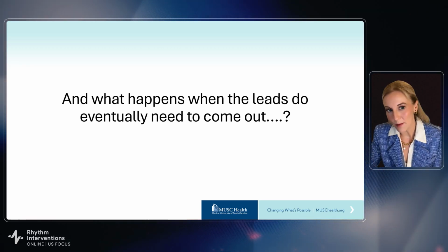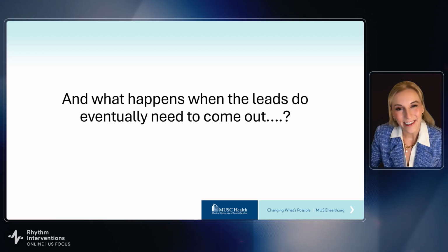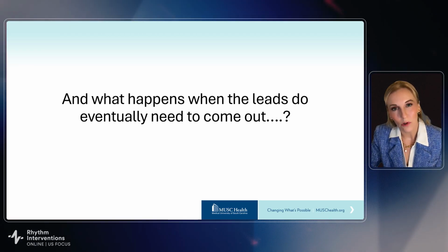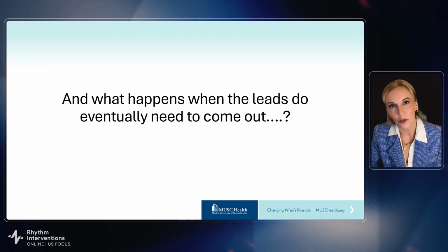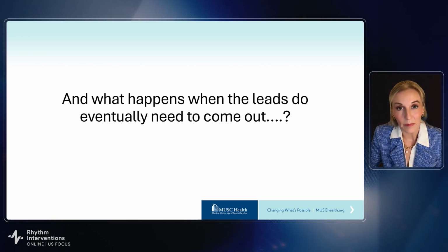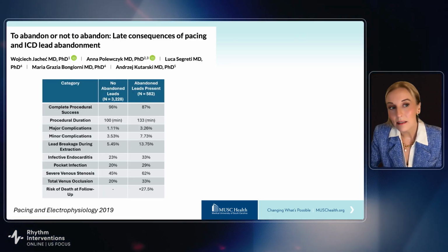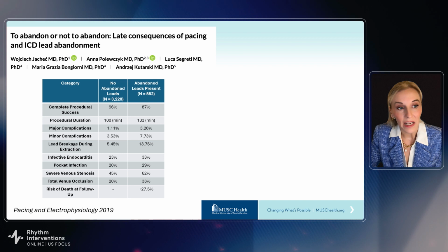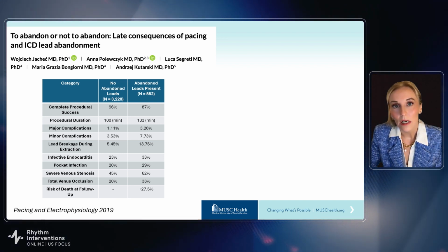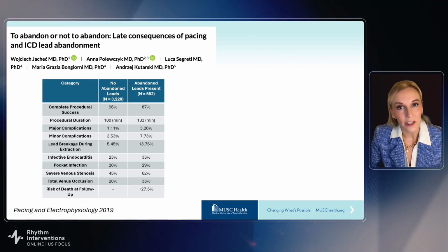And what actually happens when those leads eventually do need to come out? This is another side of the coin, where we're looking at the future long term problems that are the trade off for the short term gain, so to speak. We know through another set of studies that abandoned leads lead to longer extraction procedures if the patient does get infected or we have a reason to do an extraction.